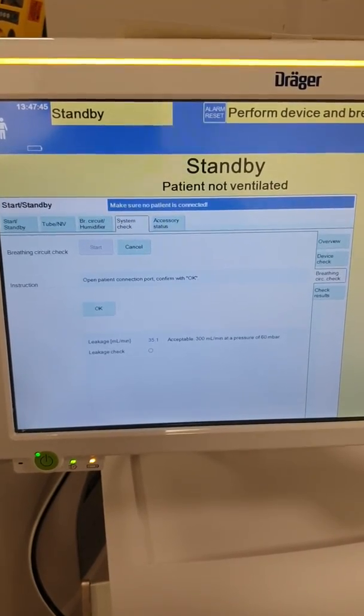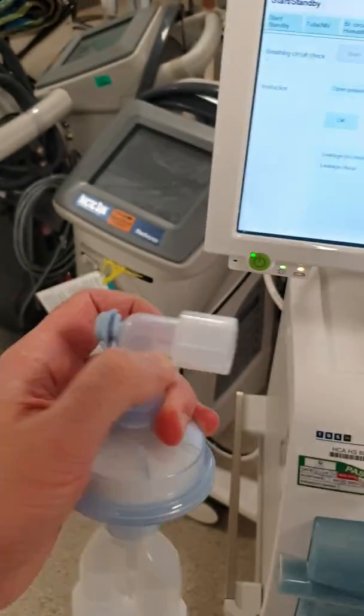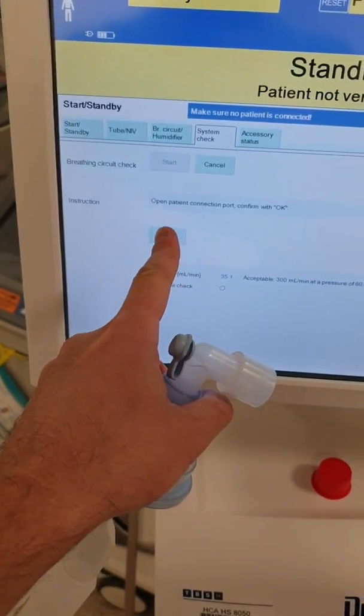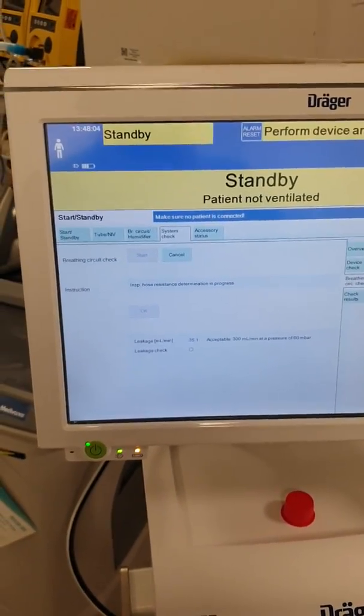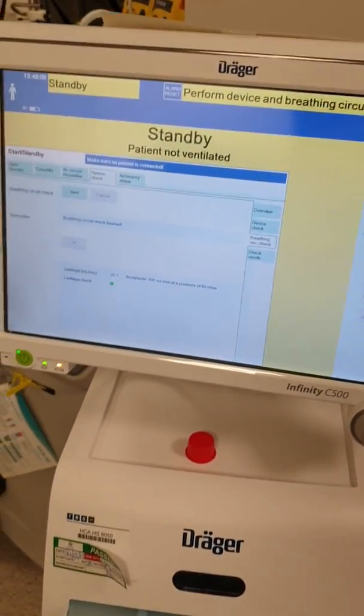Open patient connection port, confirm with OK. So I've opened the patient end and now I'm going to confirm with OK — and that's all. The machine is now ready for patient use.